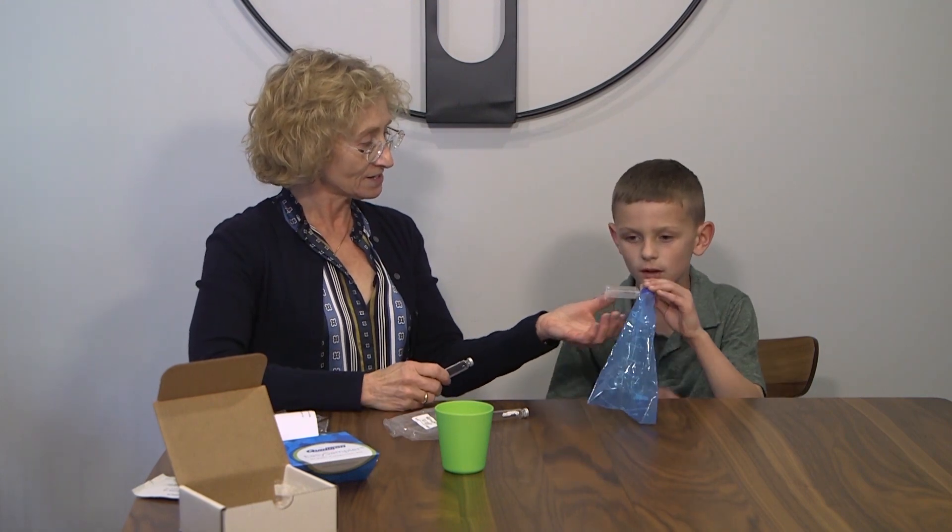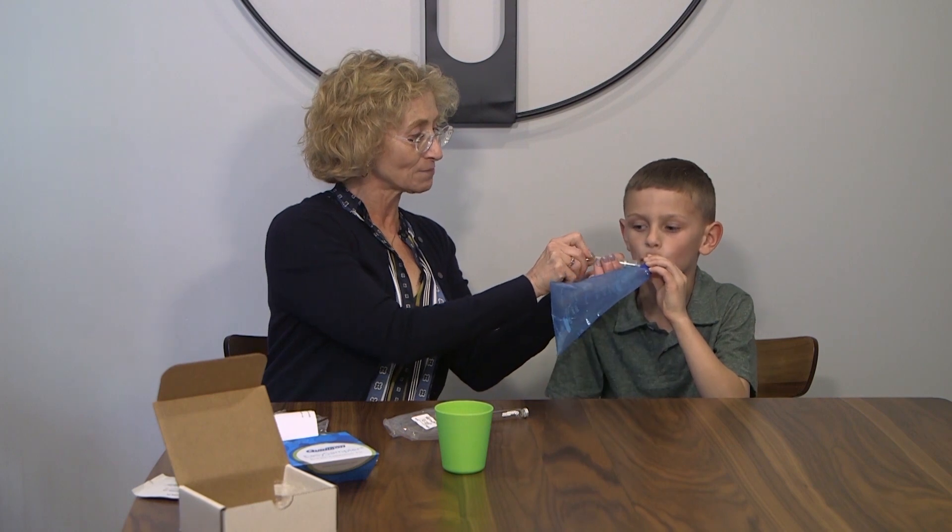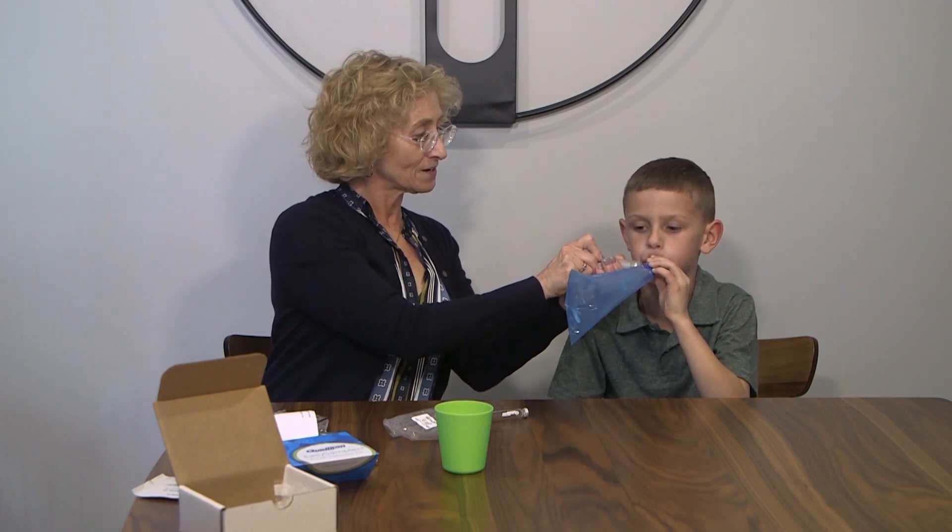So, it's been an hour. We're going to repeat this test — the same thing we did before. You're going to take a regular breath in. You're going to blow and keep blowing a constant breath while I push this in and out. I have tube number two, so go ahead and start your blow. Put your lips all the way around there. Keep blowing, blowing, blowing, blowing. Good job.